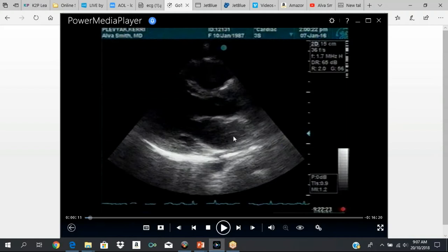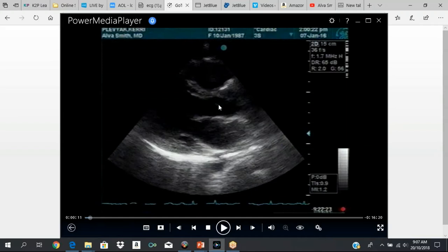This is the left atrium. Blood flow travels from the left atrium across the mitral valve into the left ventricular cavity. This is your left ventricular cavity. This is your ventricular septum. This is what we call the left ventricular outflow tract. Your aortic valve is right here. The aortic valve opens in systole and closes in diastole. And this is your aortic root going into the ascending aorta. Your right ventricle is right there.